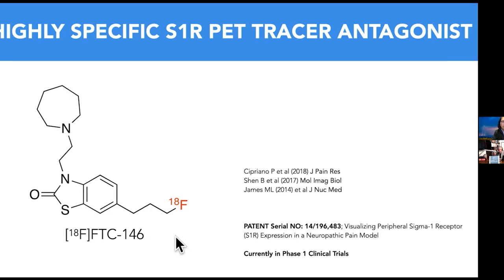The interesting thing about this molecule is that it also ends up being an antagonist. So my colleague, as I mentioned, Chris McCurdy, who invented this molecule, is also interested in potentially seeing if this will be an analgesic in its own right with a cold version of fluorine on it. That's interesting because I was going to ask you that question after your presentation. Did you see any pain reduction in patients that underwent this imaging when they had this radioactive ligand?